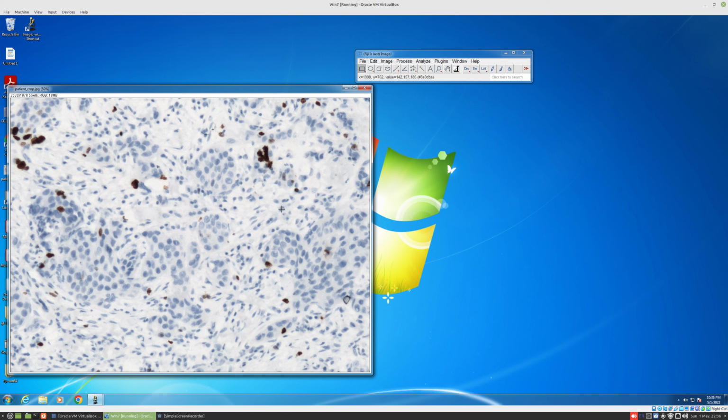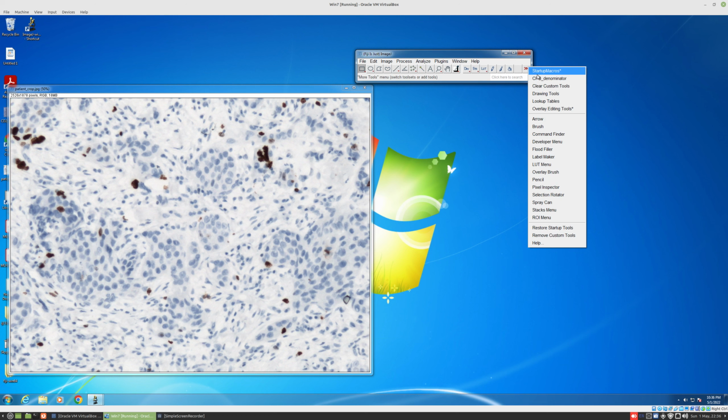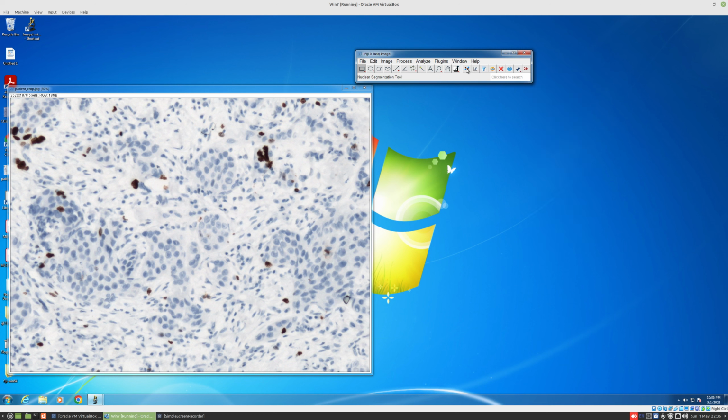When you get these data, you'll need to enter them under, so first of all, you need to activate the script I was talking about. So you click here, and you can see more tools menu, and you see CPS Denominator. You click on this, and we have these new buttons that I will explain shortly.